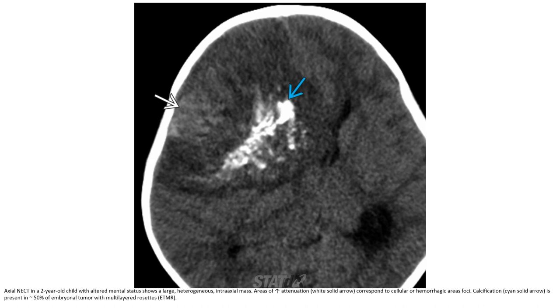Non-contrast CT in a 2-year-old child with altered mental status shows a large heterogeneous intra-axial area of increased attenuation corresponding to cellular or hemorrhagic areas. Calcification is present in 50% of embryonal tumors with multi-layer rosettes.